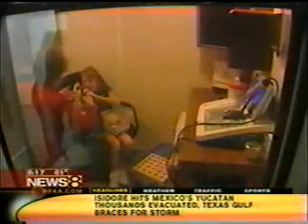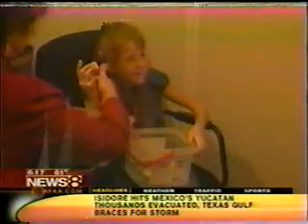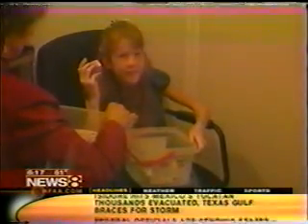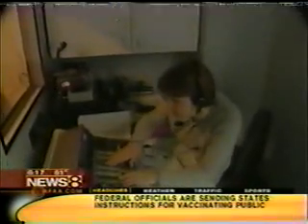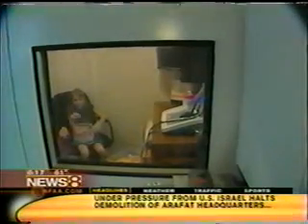Yes. Terrific. Tell us a little bit about the implant and how this works and how it's helping Amanda. Well, the cochlear implant is for people who have severe to profound nerve deafness. And it's a computer that's actually implanted inside the head. And then there's a speech processor and microphone and transmitter on the outside that communicates with the computer on the inside. And it actually electrically stimulates the damaged nerve and creates hearing in the brain.